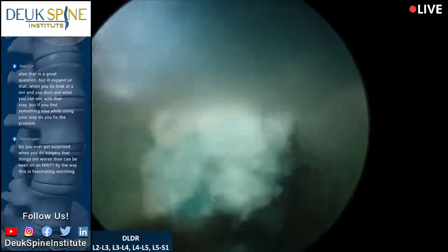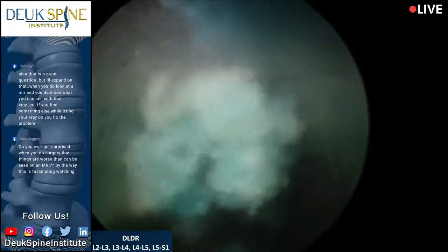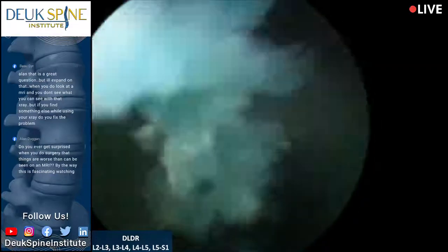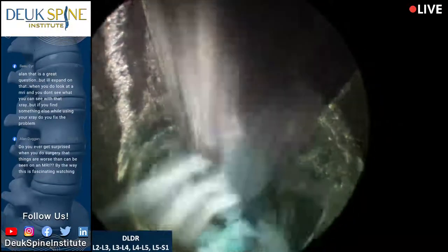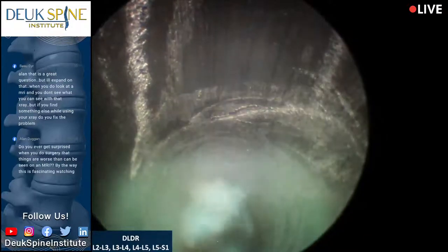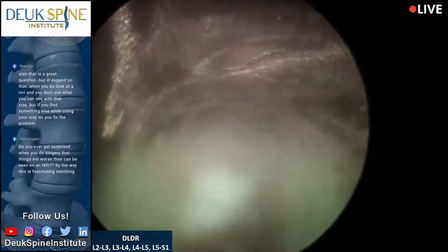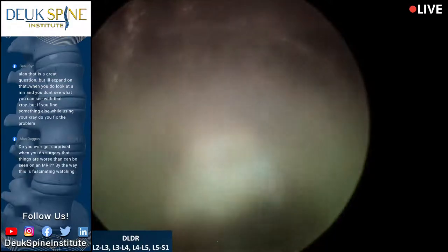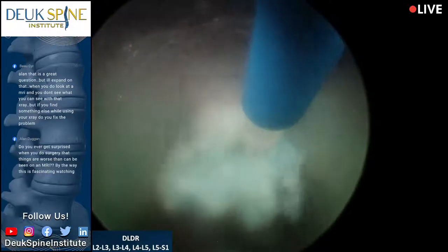So some of our viewers don't understand movement. They think that when the patient moves that they're experiencing conscious pain, but they're not. There's two types of pain. There's conscious and unconscious. And unconscious pain is, of course, as I'm doing this surgery, there's really pain, but the patient's not feeling any pain because they're sleeping.